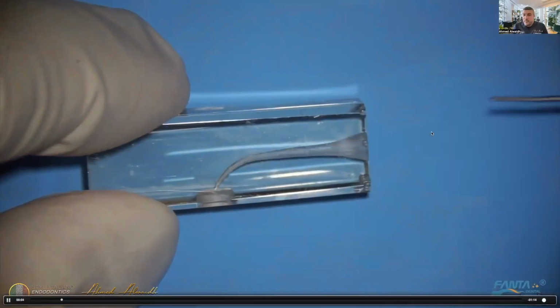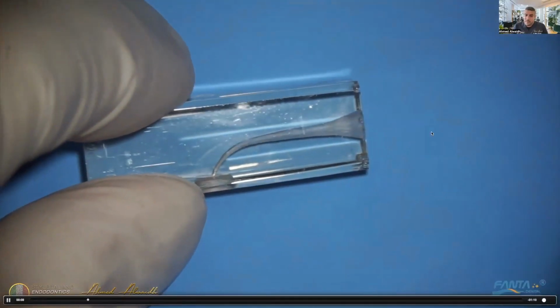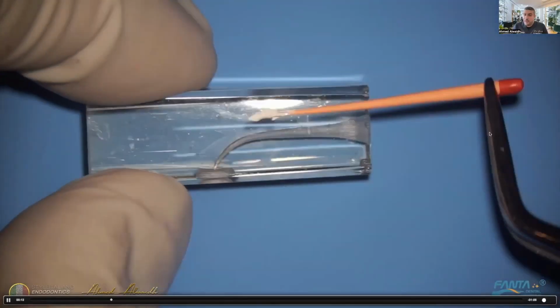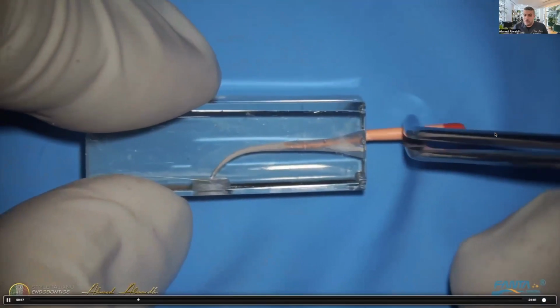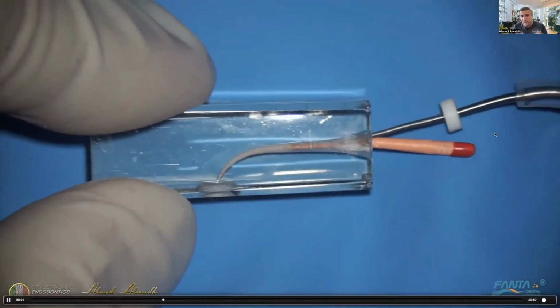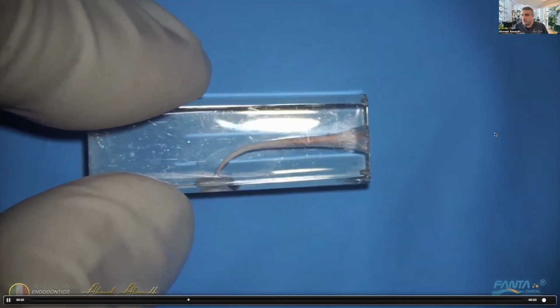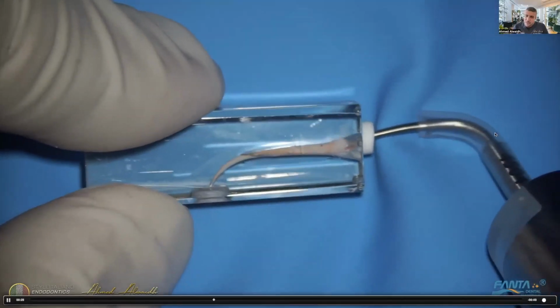First, we check the tip size. It should go 5 millimeters from the working length of the heater. Then we check the tips of our pluggers. This is the amount of sealer we need in continuous wave compaction, only a small amount. And if you can see, the whole canal is coated with the sealer. No need to use a Lentulo and put a lot of sealer. No.